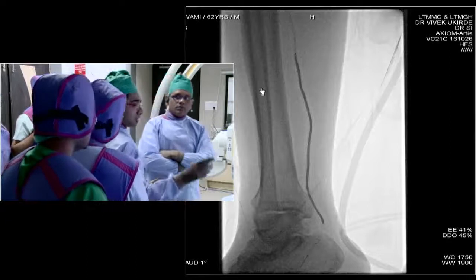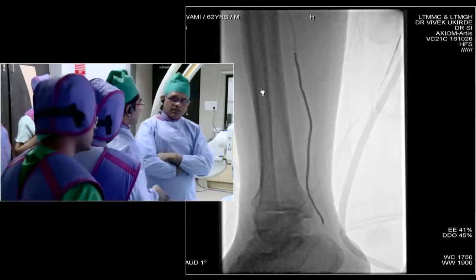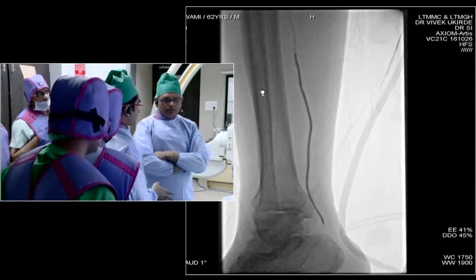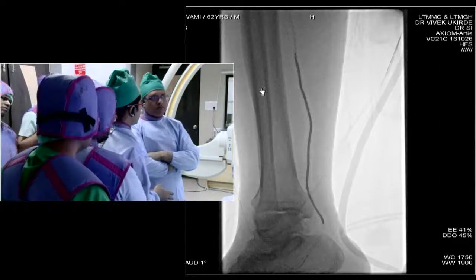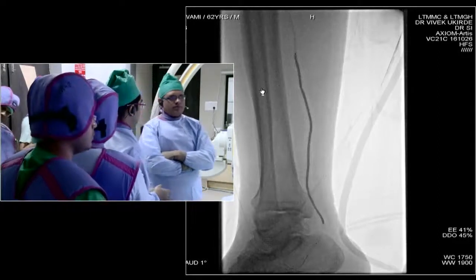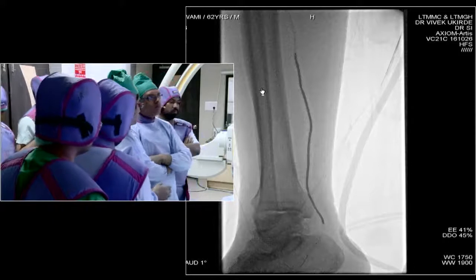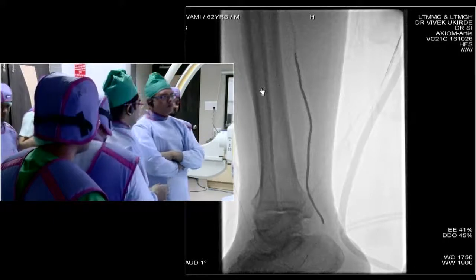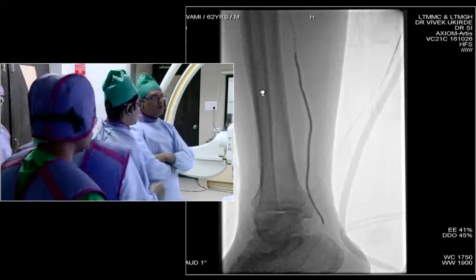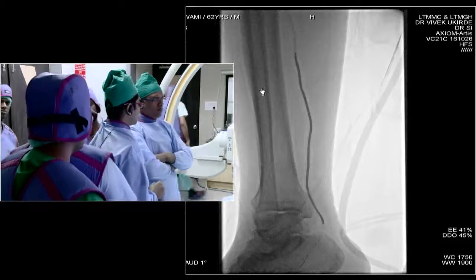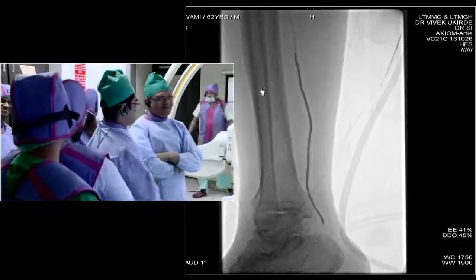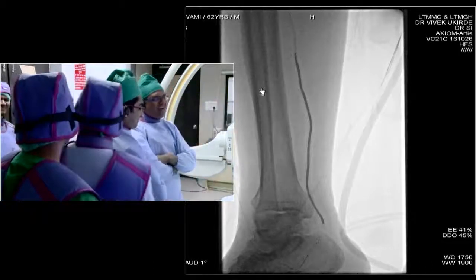In peripheral interventions, this waiting time is something you have to give for all patients — this is prolonged dilatation. You have to have patience and just keep waiting for that period. If you are a little more anxious, you should get out of the cath lab; otherwise you try to do things very fast.